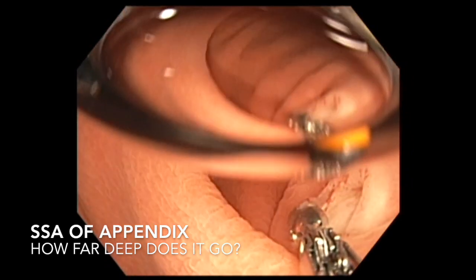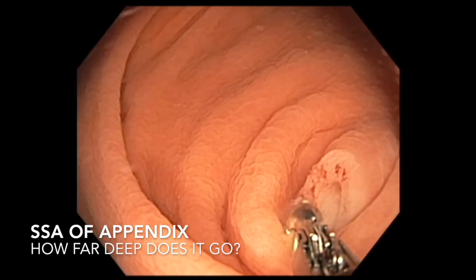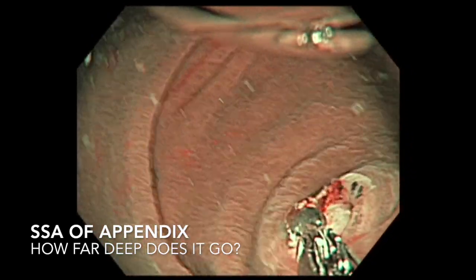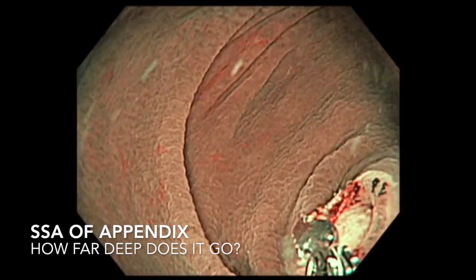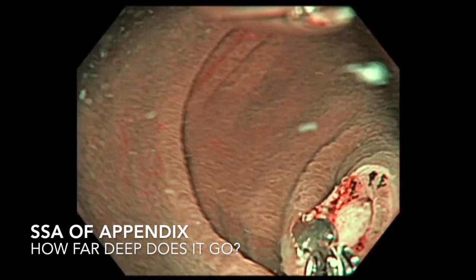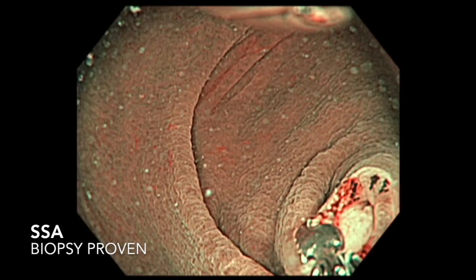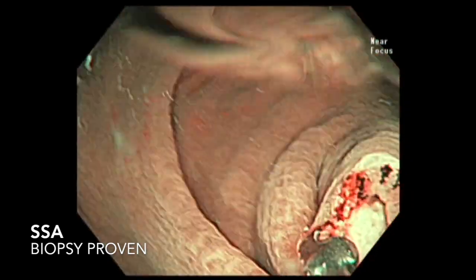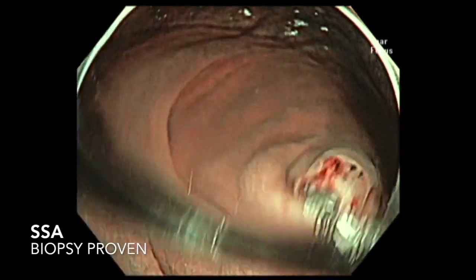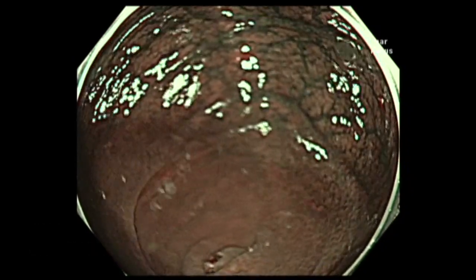This is a lesion that would typically require surgery. One could do a cecal base resection and examine the appendix during surgery with frozen sections. If there is no cancer, cecal base resection would be sufficient; otherwise, a right hemicolectomy may be required. The biopsy here proved this lesion to be a sessile serrated adenoma.